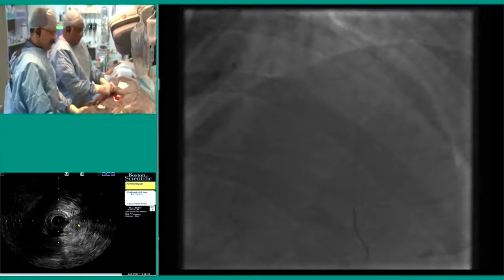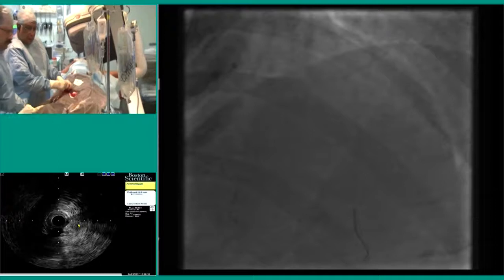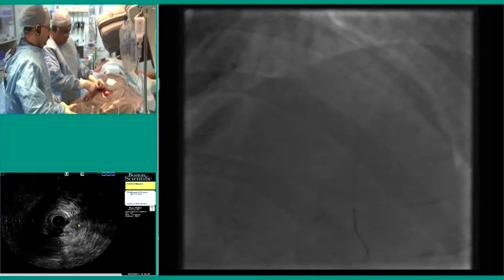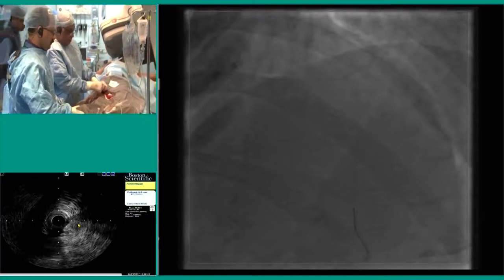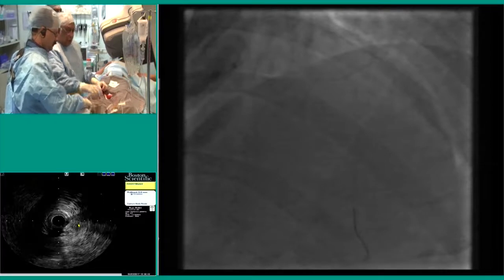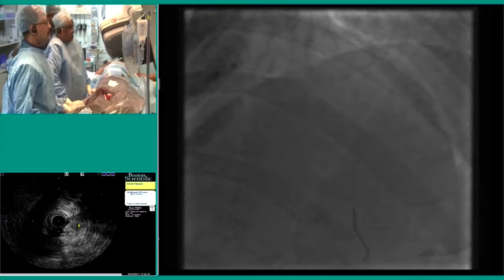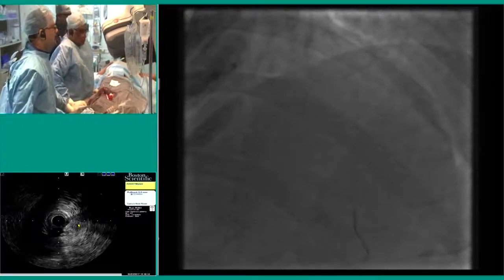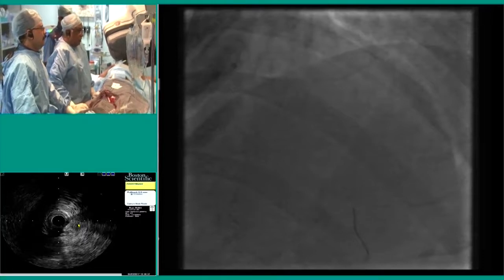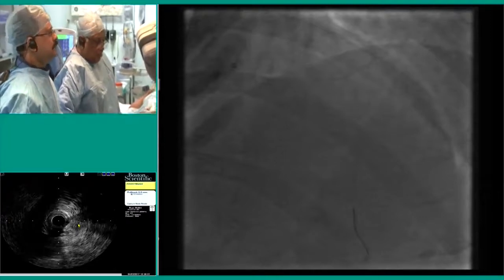All of you saw the case and the difficulties they had. There was no obvious calcium on the fluoro. I mean, it's a standard case. All of us would attempt. The ostium of the LAD is free of disease. What they intended to treat was the LAD just maybe 5 millimeters away from the ostium. There is, of course, a large diagonal of fair size with ostial disease.